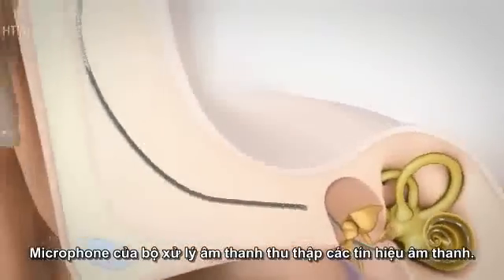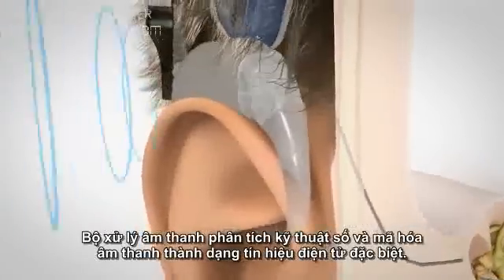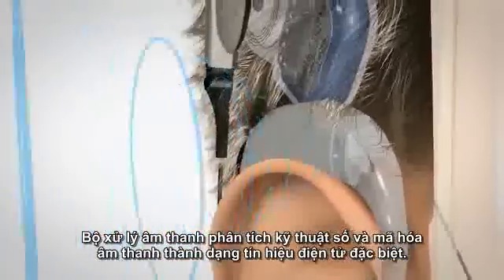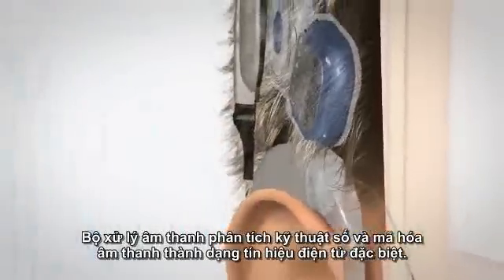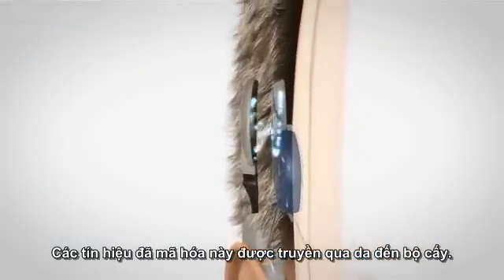The microphone of the audio processor picks up the sound signals. The audio processor digitally analyzes and codes sound into a special pattern of coded electrical signals. These coded signals are sent to the coil and are transmitted through the skin to the implant.